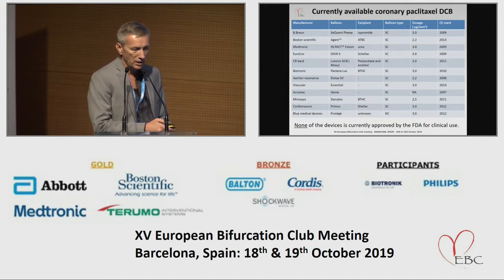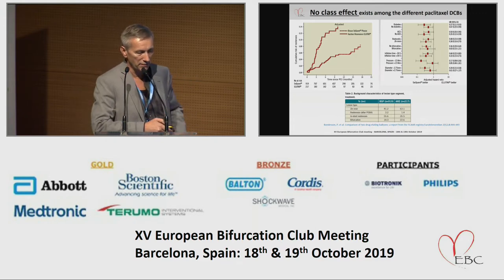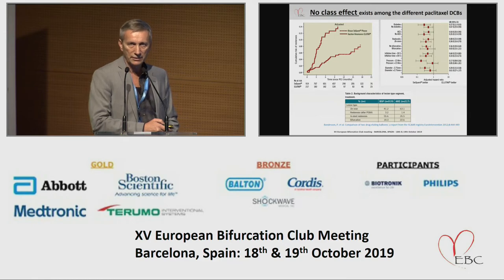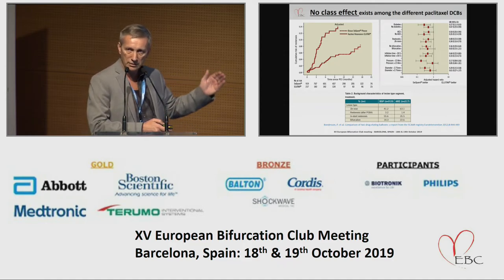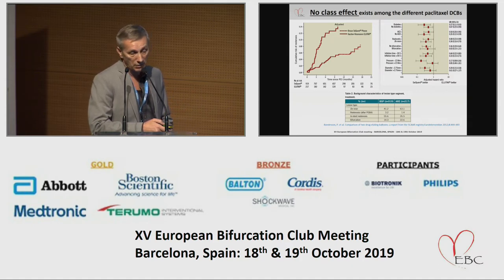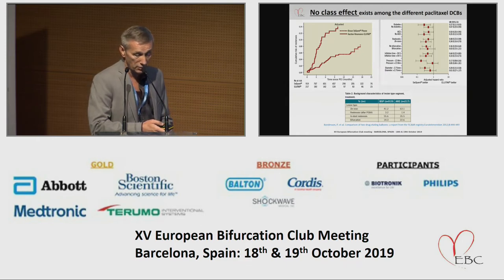Mostly on the semi-compliant balloon, but differences in excipients. And I think that it's very important at the beginning to emphasize that there is no class effect. There are data for it, and in this data from a real-world large registry from Sweden, we can see major differences in restenosis between two balloons used in 1,100 patients in every subgroup, including bifurcations, and bifurcations were the indication in 20% of the drug-coating balloons.